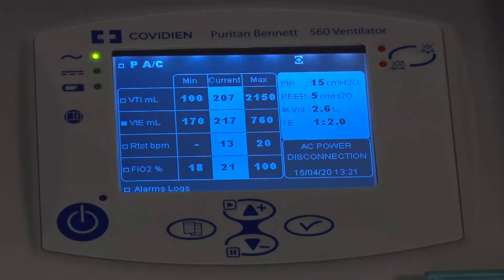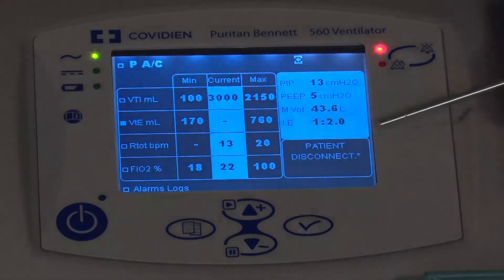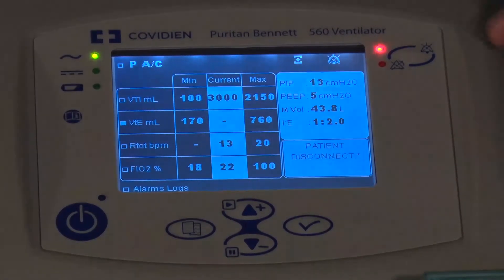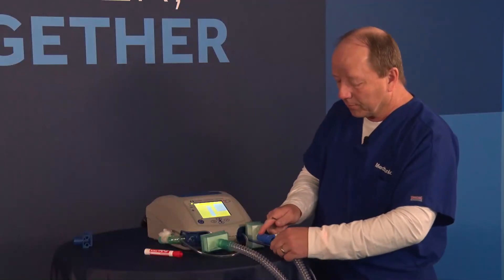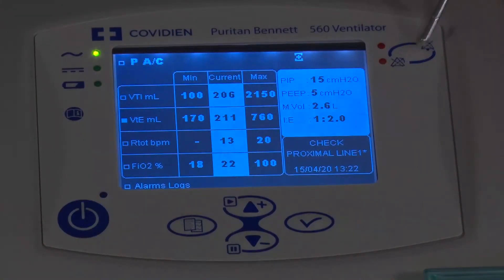Here's another example — disconnecting the circuit. You determine how long before the disconnect alarm goes off, and it says patient disconnect with both an audible and visual alarm. If I press it once, you see the alarm indicator shows it has been silenced. Even though you silence an alarm, if a secondary alarm comes in, it may reactivate the alarms. Reconnecting the circuit clears those alarms.